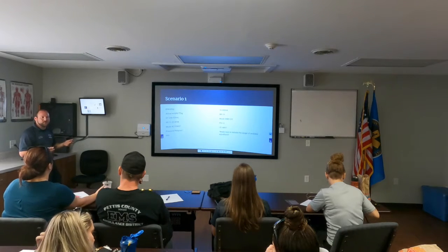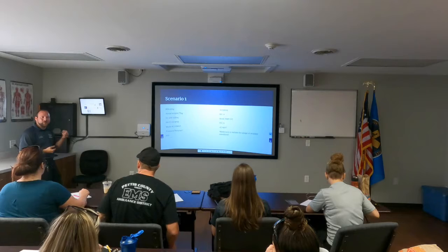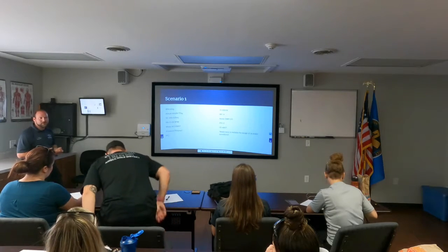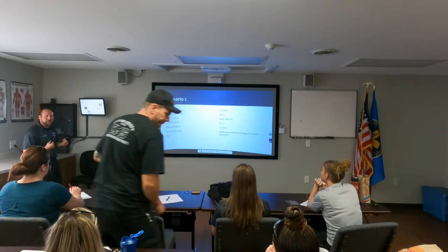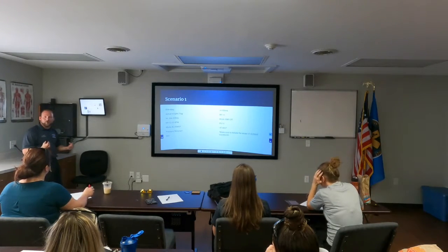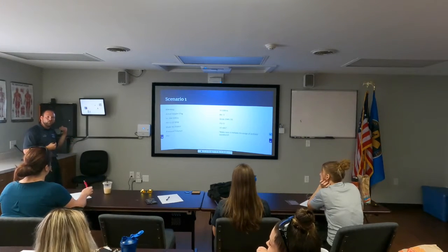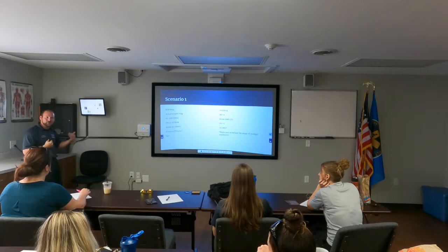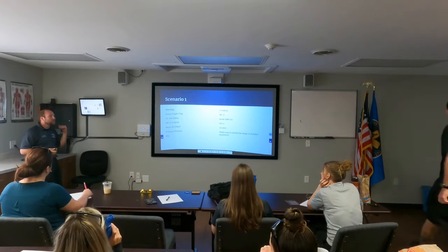One of the biggest problems with the vent for our patients is that the more we use long-term paralytics on these individuals, the diaphragm is a muscle that loves to give up when someone else is doing the work for it. We are negative pressure ventilation just by nature, and once positive pressure ventilation is introduced, the diaphragm's like, I don't have to work anymore, someone else is taking over, deuces, I'm out.